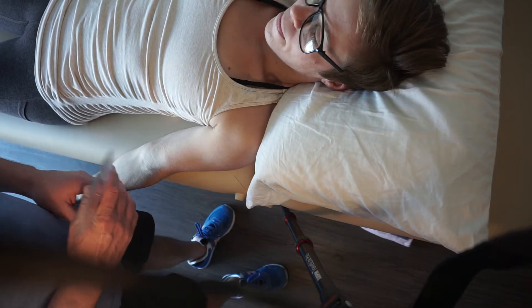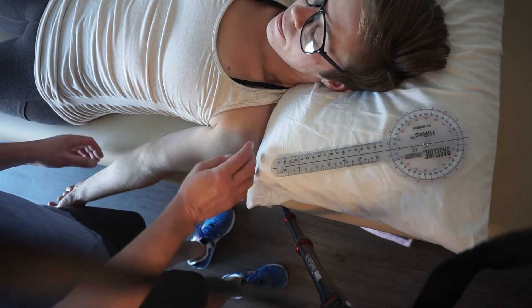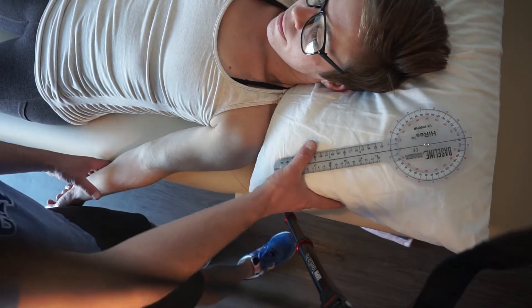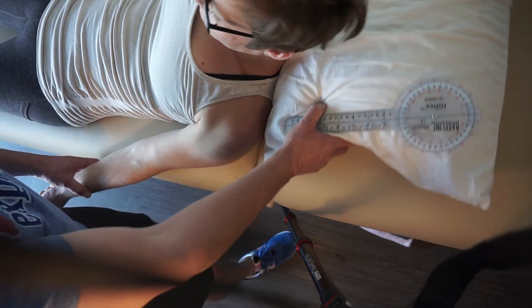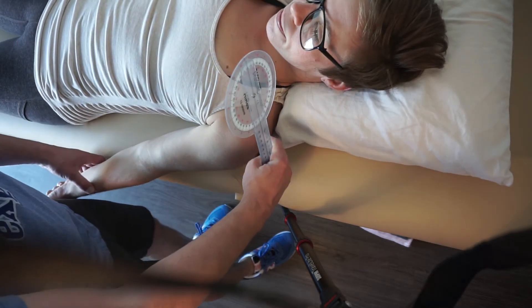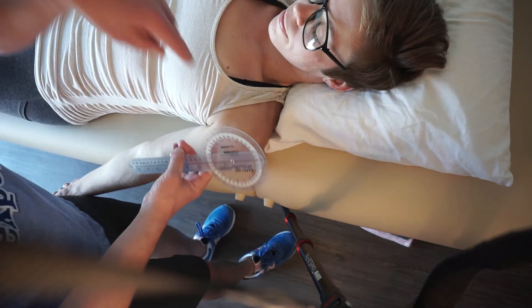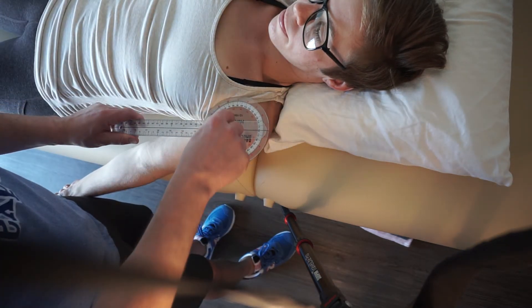In this video we're going to look at shoulder abduction. The fulcrum is going to go over the anterior aspect of the acromion — that shoulder pad bone. You may need to have the patient lift their head a little bit. Come right to the anterior portion and create a fulcrum that goes infinitely down.